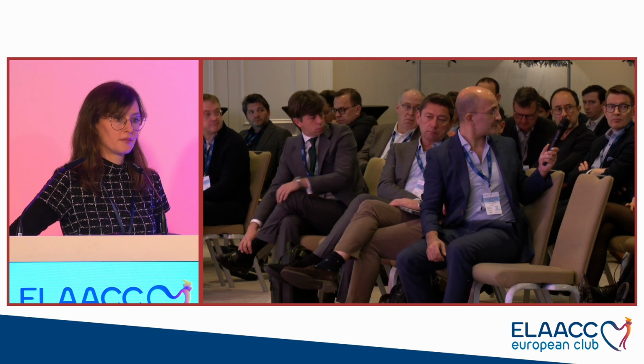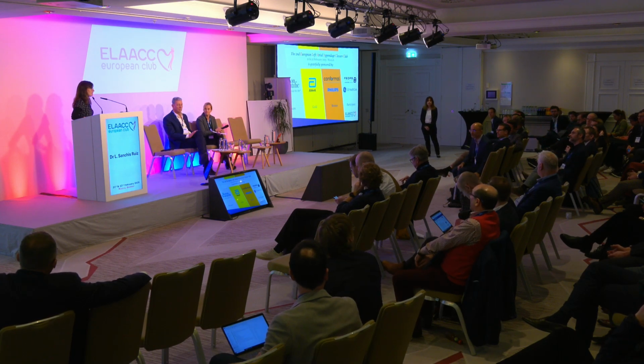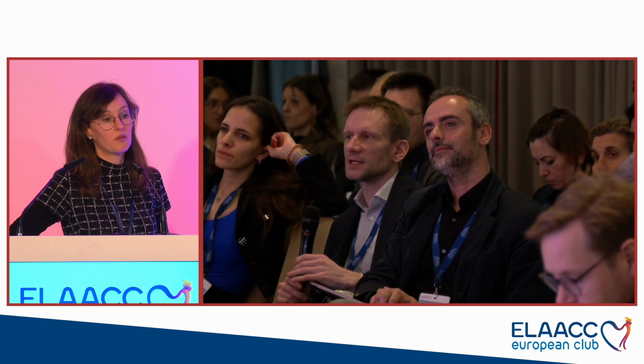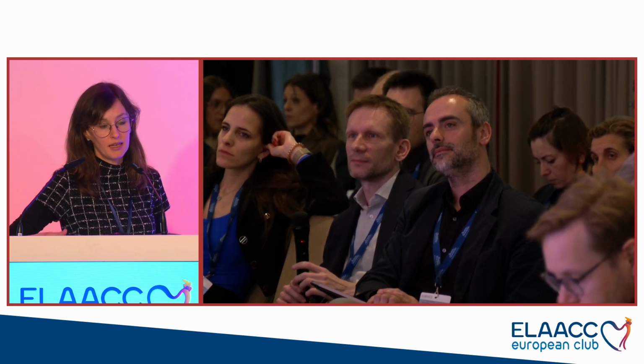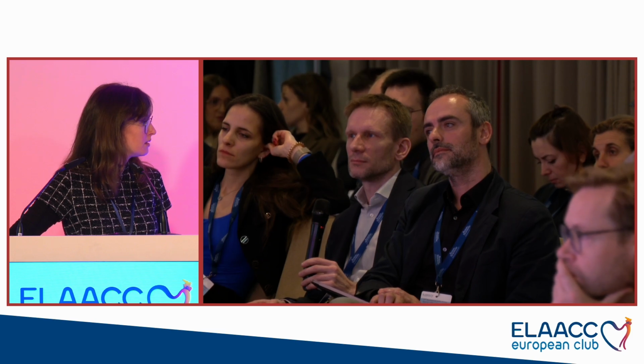Yeah. Do you use the same mini TEE pre-procedurally then, is the question. No. In the echo lab, we use the standard one. So you don't do the pre-procedural echo part there. You do everything in the lab? Yeah, yeah, okay. That's a point I wanted to make. Screening, especially because we are involved in some studies and we need to screen. You do the pre-procedural screening with the standard TOE, or CT?